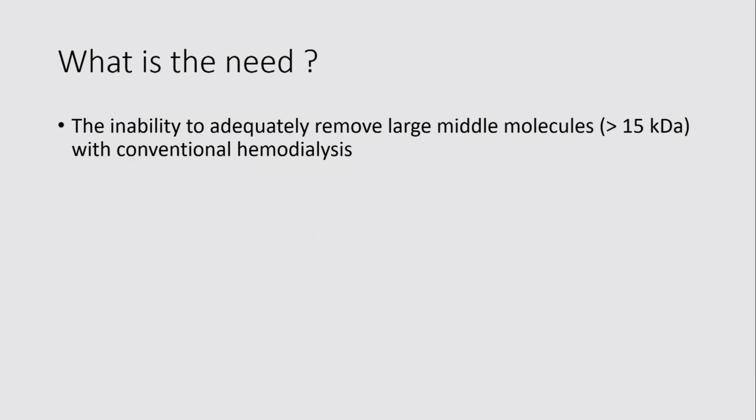It is basically the inability to adequately remove large middle molecules, more than 15 or more than 25 kilodaltons, with conventional hemodialysis. That is the limitation of conventional hemodialysis, which is tried to be overcome by these newer technologies.